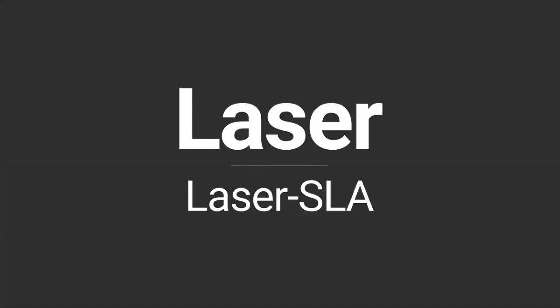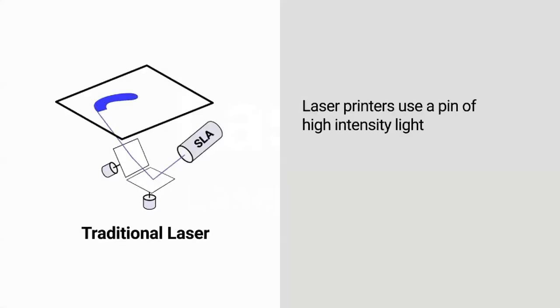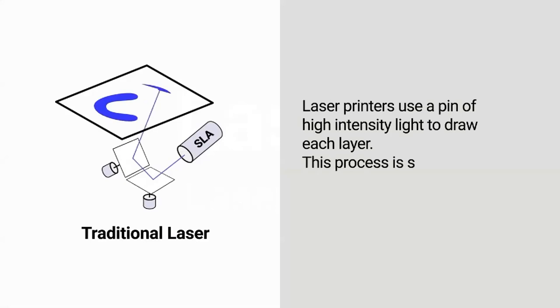So of course, the two most popular technologies are SLA and DLP. So here are a couple of videos illustrating how those two technologies work.